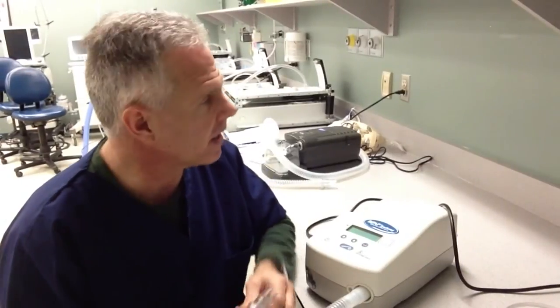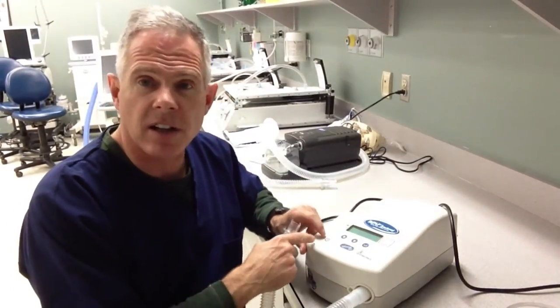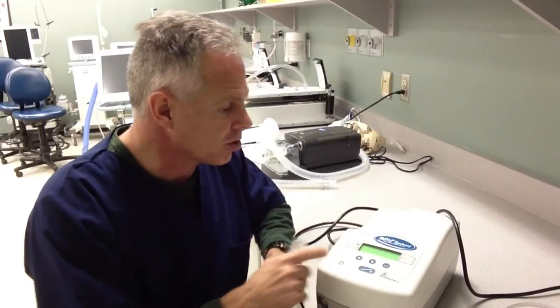How do we turn this device on? It's just simply plugged into the wall. It's got a little on and off switch here, so we just turn that on. Initially it'll do a quick self-test.